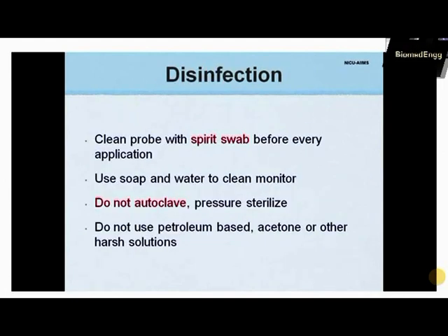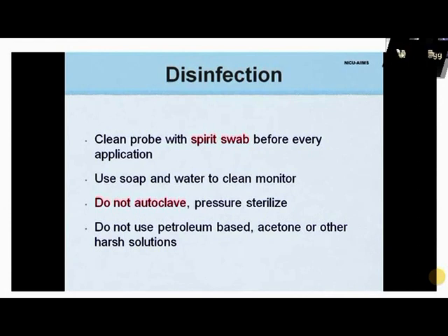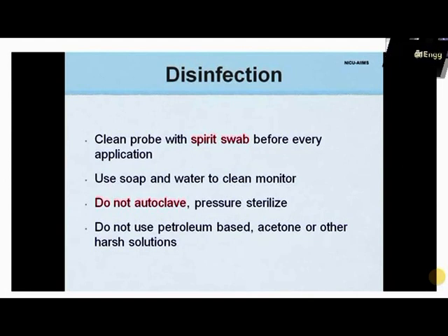Disinfection is as important as careful handling. Probes should be cleaned with a spirit swab before every new application. The front panel can be cleaned with soap and water. The unit does not need autoclaving or pressure sterilization, and petroleum-based products, acetone, or other abrasive liquids should never be used to clean it.